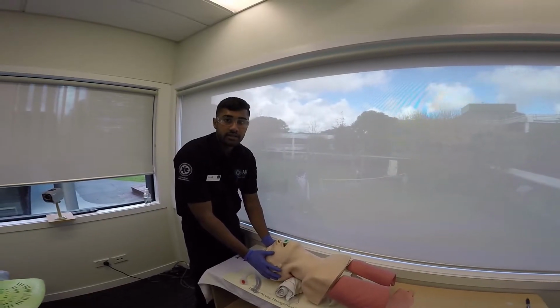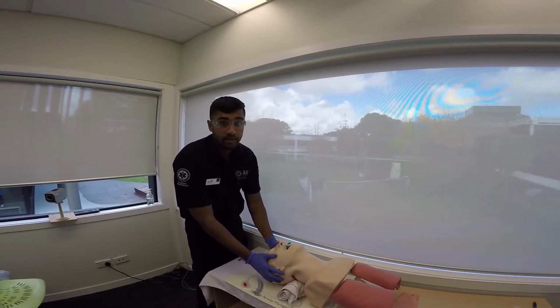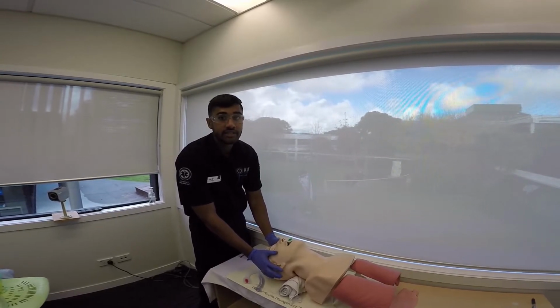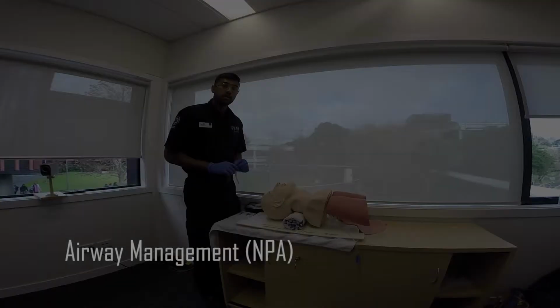Complications that could arise whilst using an OPA are damage to the oropharynx and induced vomiting if the OPA is too large. A reason for using an OPA is if the patient has a GCS of less than 8 or scores less than 2 for the verbal response.